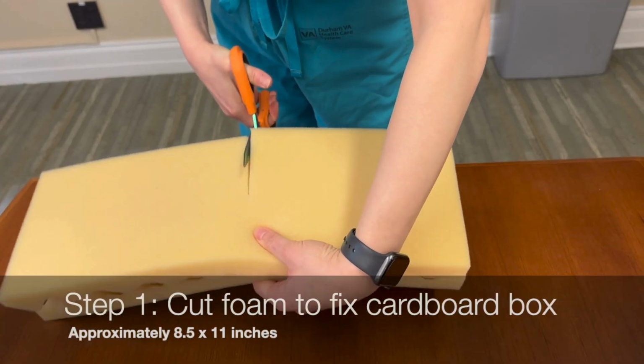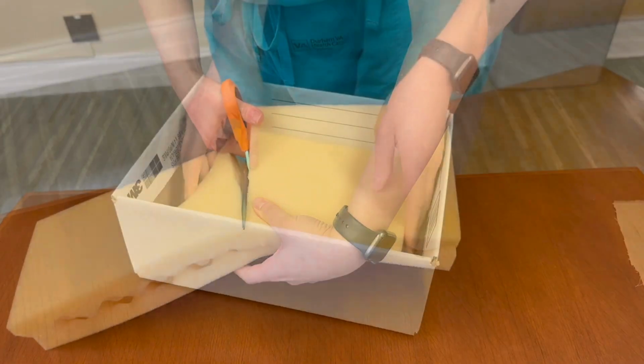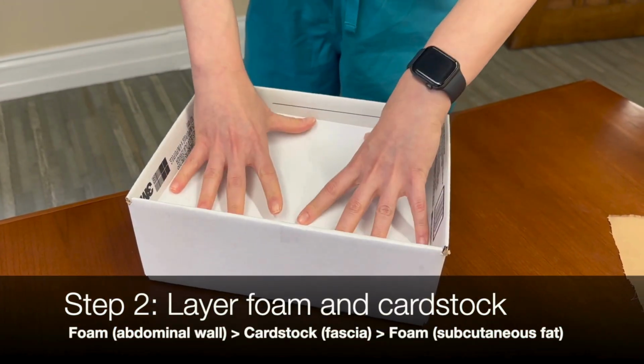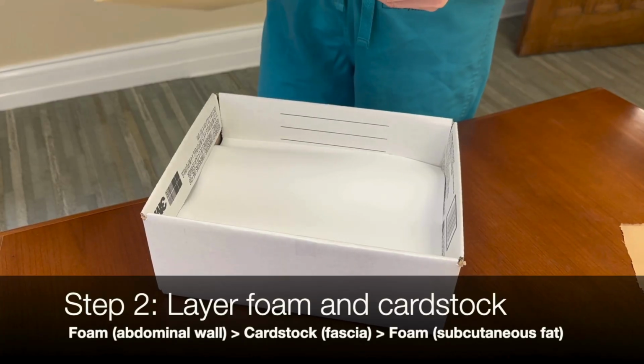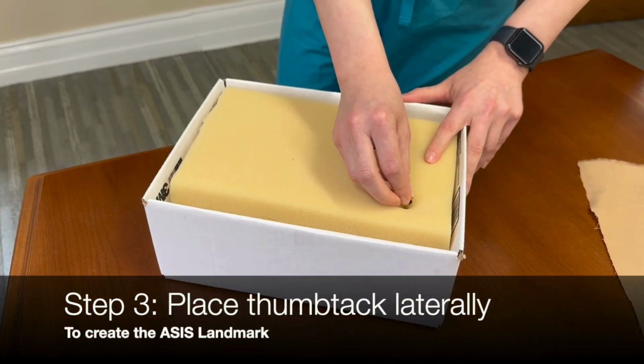Now, let's get to building. Start by clipping the convoluted foam to fit the cardboard box you have secured. Then place one layer of foam to represent the abdominal wall. Add your cardstock paper to simulate the fascia. The third layer is also made of foam, to simulate the subcutaneous space.